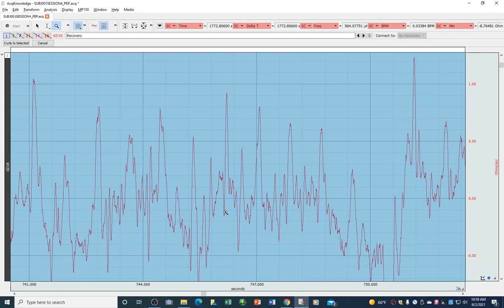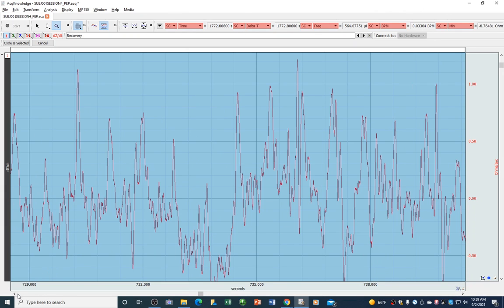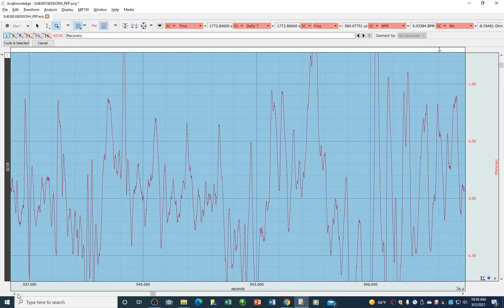And unfortunately, this is a completely worthless signal. So this gives you a very good sense of what a worthless signal looks like. There is no rhythmicity to it at all.